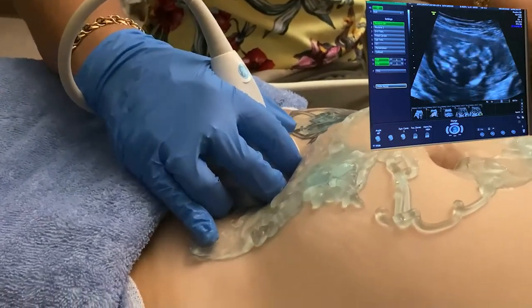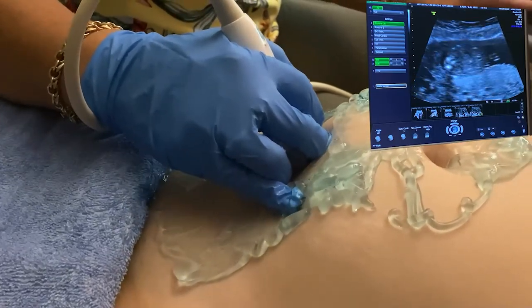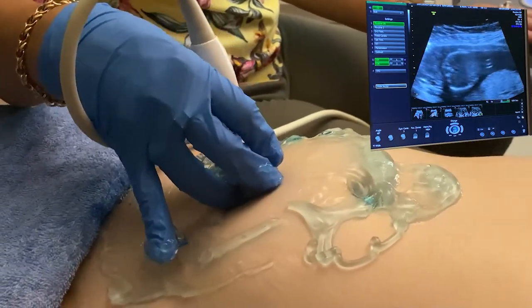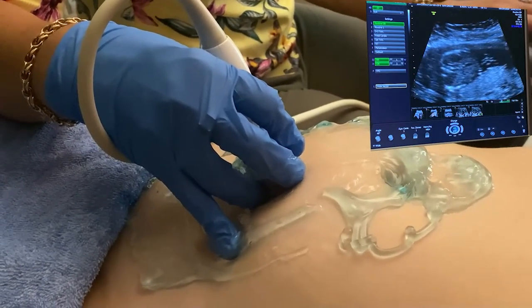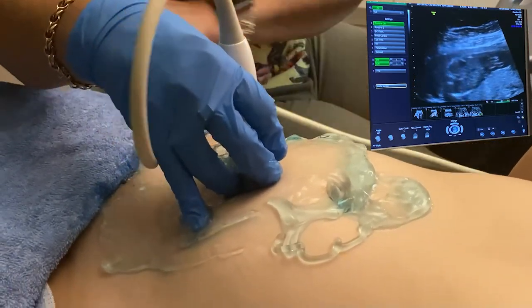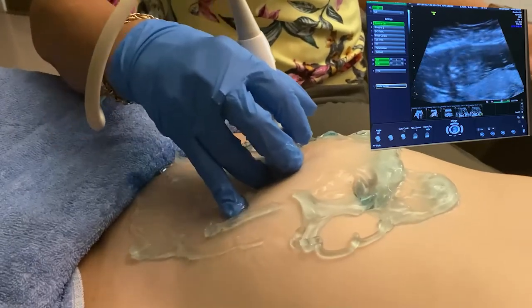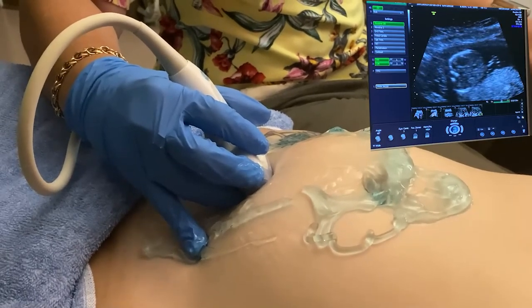And just keep going. I'm going to keep going down baby, and there's baby's heart. We'll come back to that. I'm going to get an abdominal circumference. The landmarks for the abdominal circumference are the stomach and the umbilical vein as it comes in and hooks and joins the portal system. Now this baby is lying quite literally on the side of mom's belly, and so sometimes it's a challenge to make the abdomen completely round, but we're going to extrapolate from here.